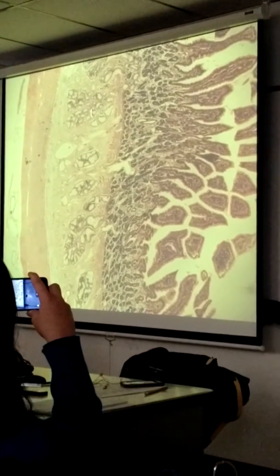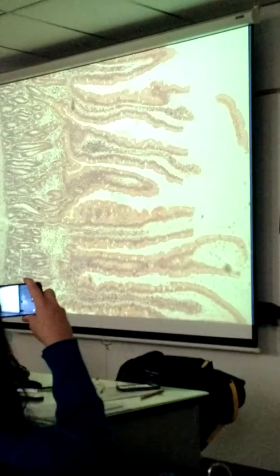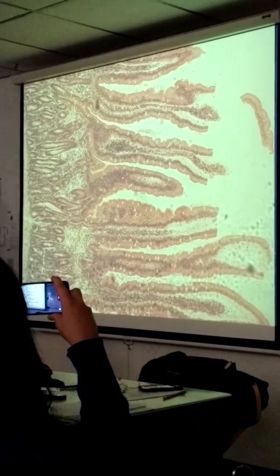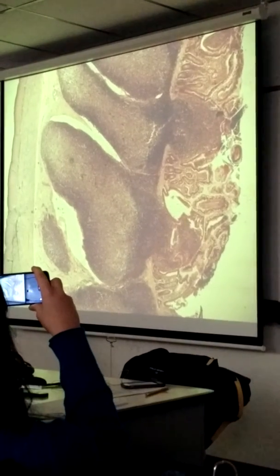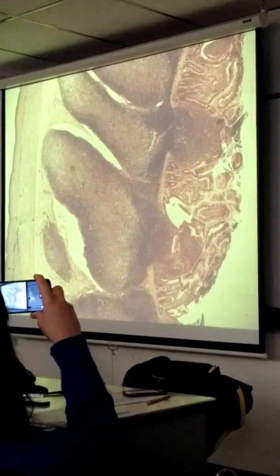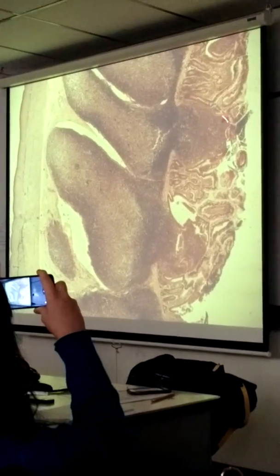Here I ask you Brunner's glands. For duodenum, I usually ask you to identify the Brunner's glands. For jejunum, I would ask you to identify as a structure the intestinal crypt and Paneth cells. There's the crypts again. For ileum, which this shows, you see MALT. The MALT are the big, you can't miss it, purple splotches. Mucosa-associated lymphoid tissue, you see it dominates the submucosa, and it is even associated with mucosa.